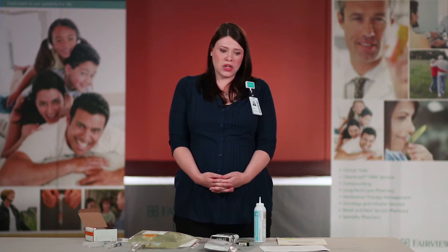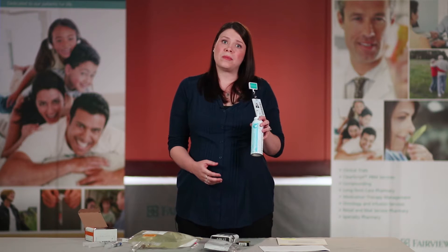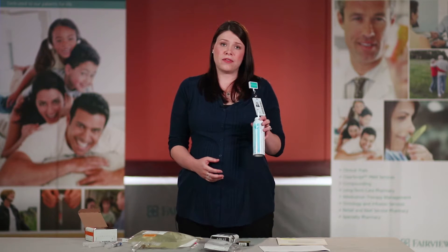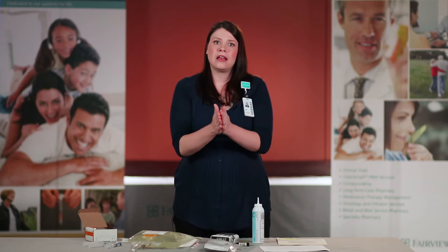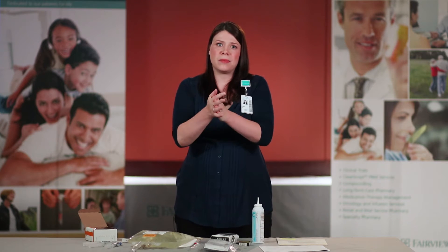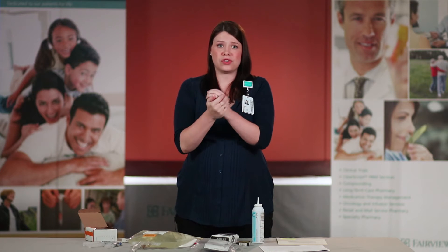If your hands are not visibly soiled, or you have not pet a pet, or you have not used a restroom, you can use the antibacterial foam that is sent with your infusion supplies. To use this, apply it to your hands, scrub your hands, and rub your hands until the product is dry.